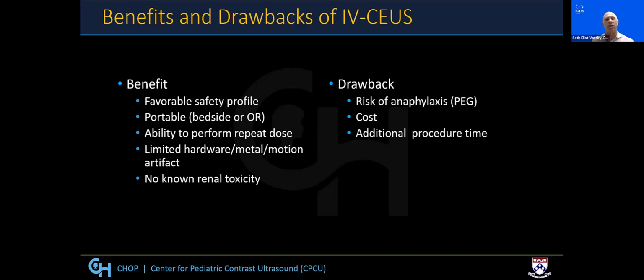There certainly is an additional cost of contrast-enhanced ultrasound, both financially and involving procedure time, but this can be offset by the improvement in diagnostic accuracy and early identification of complications and increased procedural confidence. And as you use it more in the interventional setting, it becomes more efficient and less time consuming.